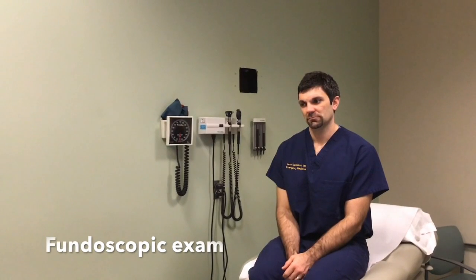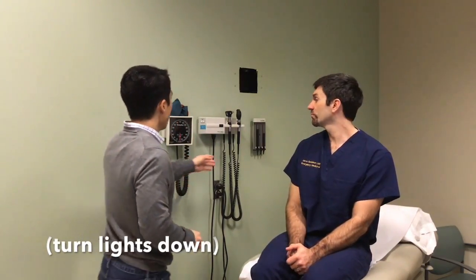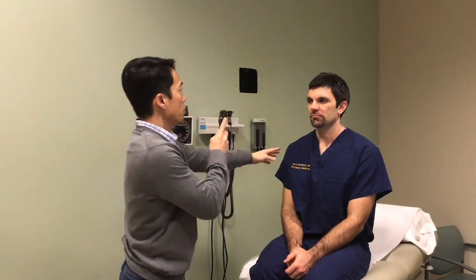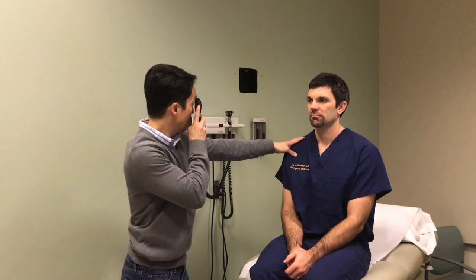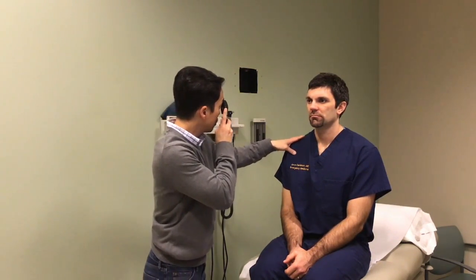Our final exam is the fundoscopic exam. For this, we'll be using the ophthalmoscope. After setting the ophthalmoscope for 0 diopter and using a small beam of light, darken the room. Ask the patient to look up and slightly over your shoulder at a point or an object on the wall. When examining the patient's right eye, use your right hand and your right eye and vice versa for the other eye. Start about 2 feet away from the patient and about 15 degrees lateral to their line of sight.